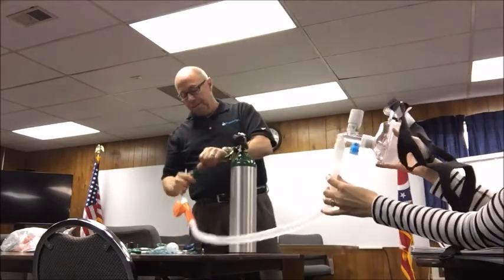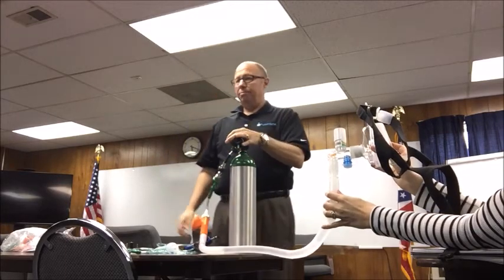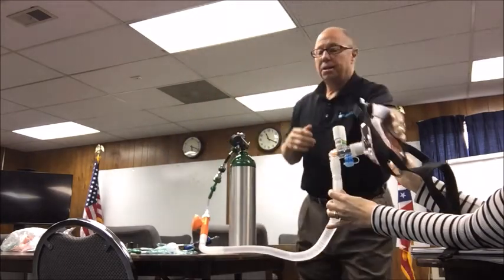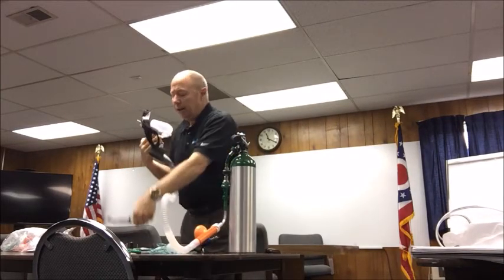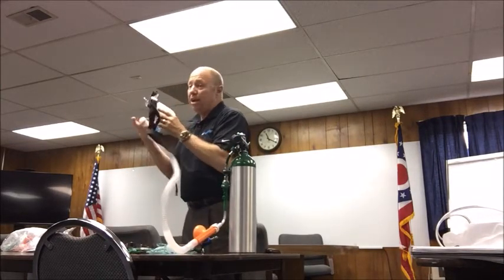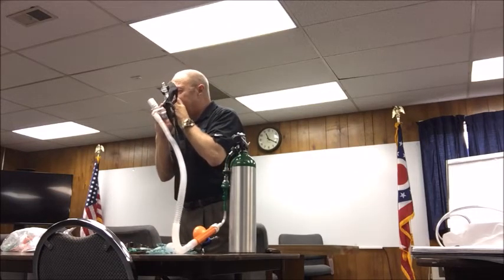To deliver CPAP, it's literally put the mask on, plug it in, that's it. Walk to the patient, coach the patient, you're going to feel a little air, they're going to feel it, and most patients, as you know, are going to grab this, because they're going to feel it, they don't need to.